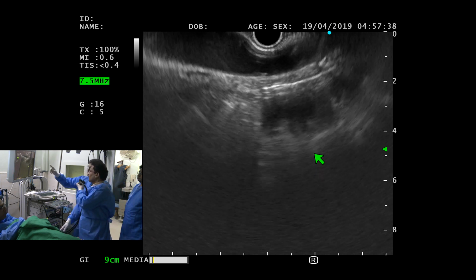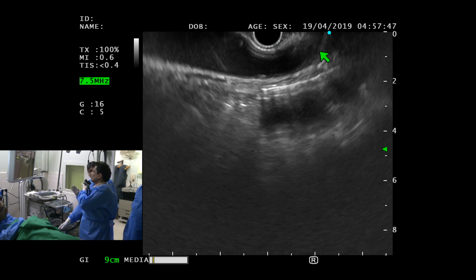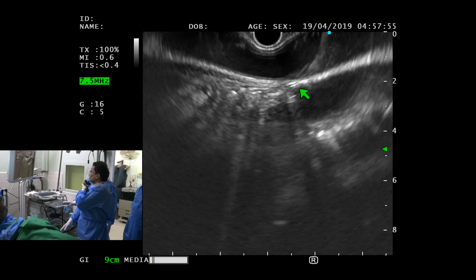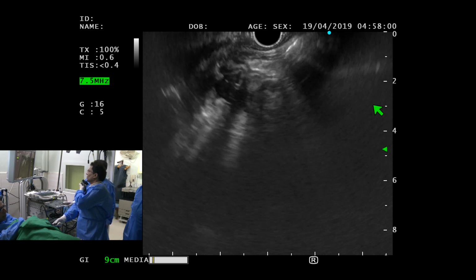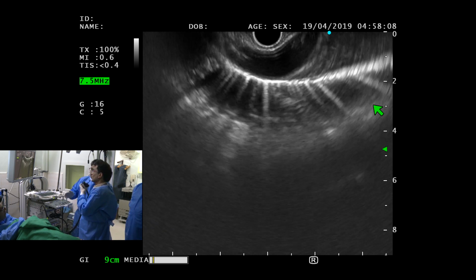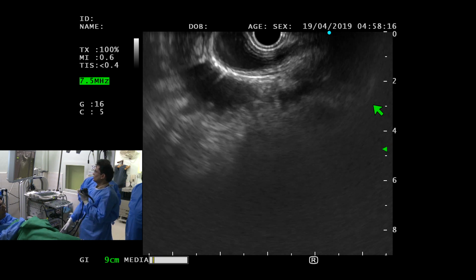Now, we know that the aorta is actually going like a pendulum. We don't want that. We have to give the aorta a slide, so that it comes from top to bottom. It's a sliding. So therefore, what you now need to do is something so that your aorta makes this trajectory. Okay? So we've lost the aorta because we've gone more clockwise. So start to relax, relax, relax. When you say relax, that means your clockwise torque starts to come anti-clockwise. Okay? So let's go a bit anti-clockwise.